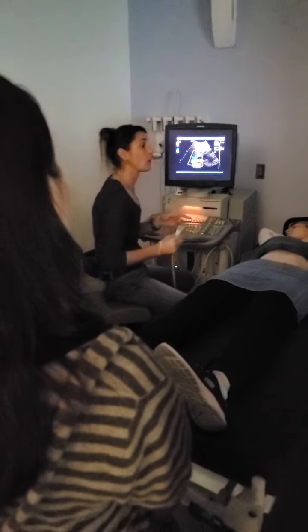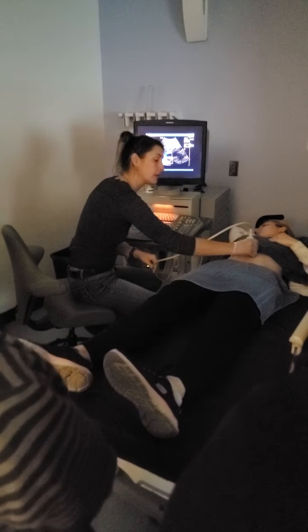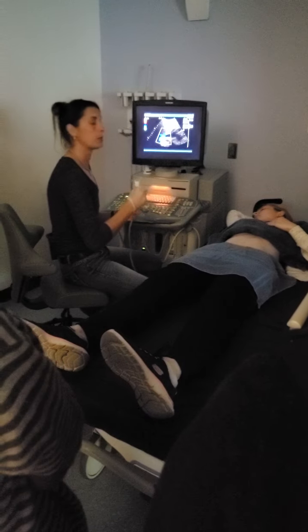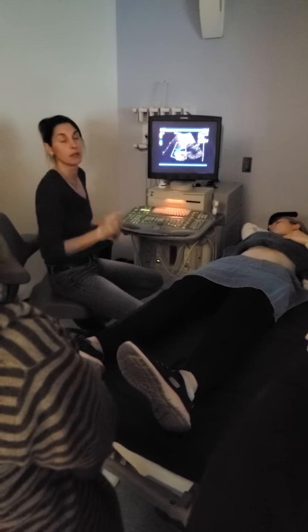Check it out. But the ones you are responsible for are going to be the main portal vein with measurements, which is going to be a midline, kind of 10 o'clock, and then that intercostal with color only. But I do encourage you to play with the rest. You'll be responsible for them the third quarter. So you can't be like, I never learned that.